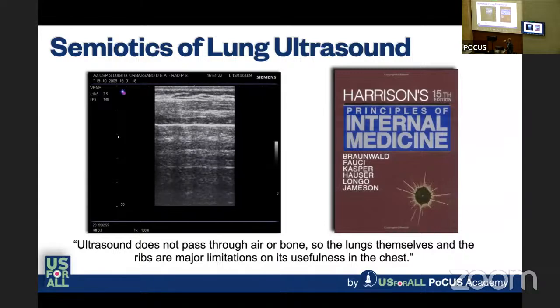And you have here the reproduction of the pleural line here. And again, another reproduction of the mirroring of the pleural line here. So it happens many times. It's like when you are in an open space, and you make a noise, boom, boom, boom, boom. So it is a reverberation.